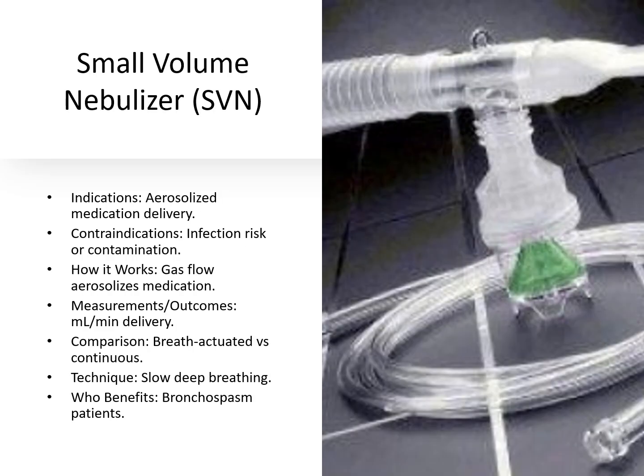A small volume nebulizer delivers aerosolized medication. Contraindications include increased infection risk. It works by using gas flow to aerosolize liquid medication. Measurements include the flow of medication in ml per minute.